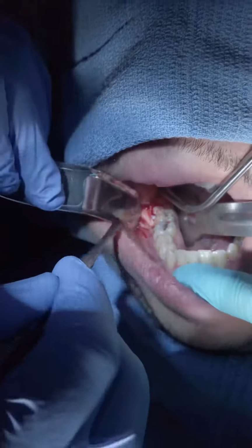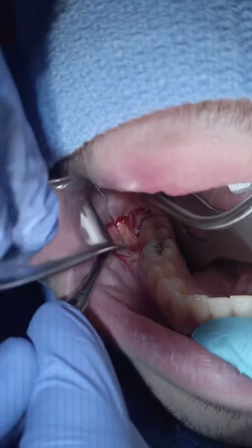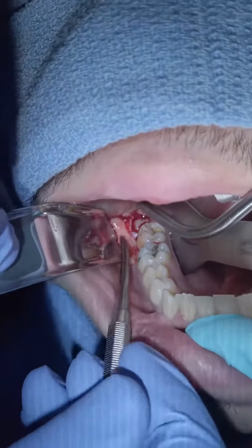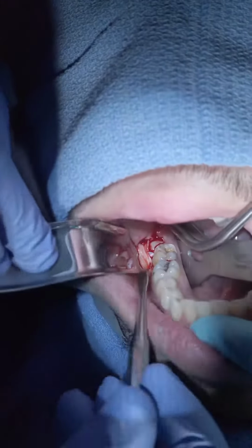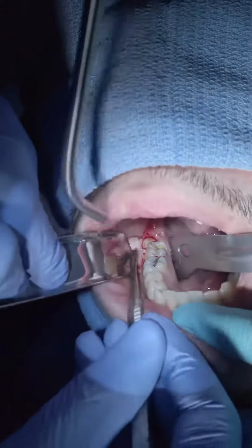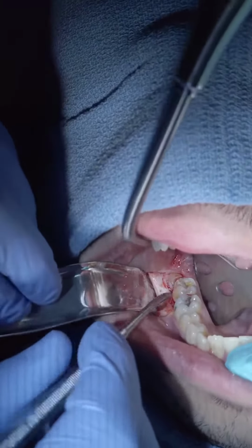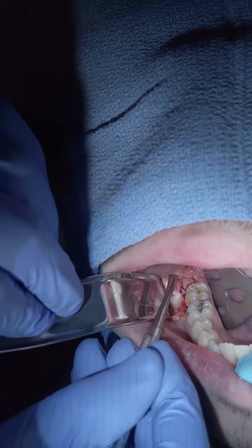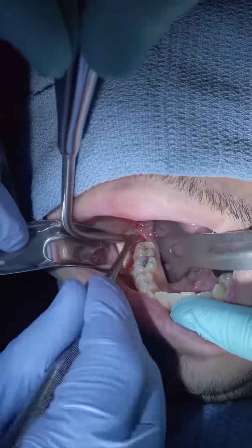So you see that bone right there? You want to make sure that's the only thing we see when we're reflecting. You don't want to tear your flap because that causes a little bit more swelling, and it's going to take a little longer for that area to heal, okay? Really get up under that sucker right there. See how that Minnesota is right there? It's where we want our Minnesota. We'll reflect a little tissue right there because we don't want that to hold us up.